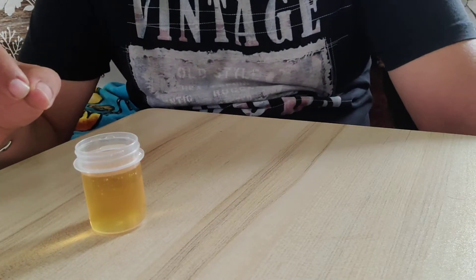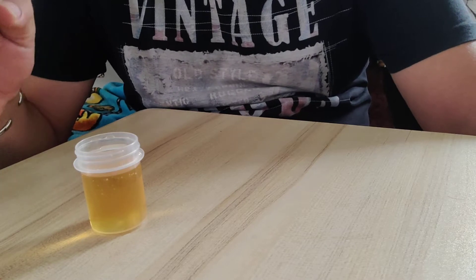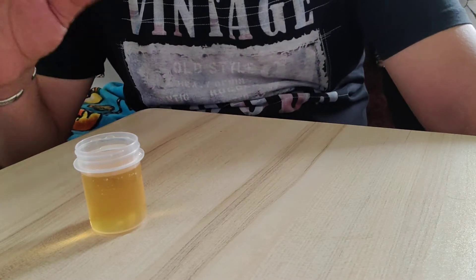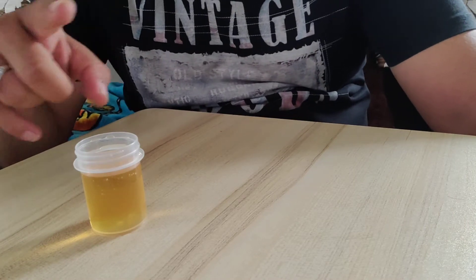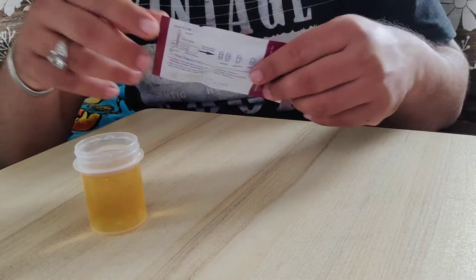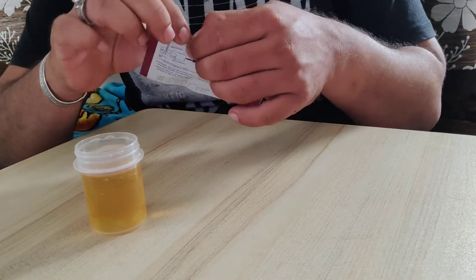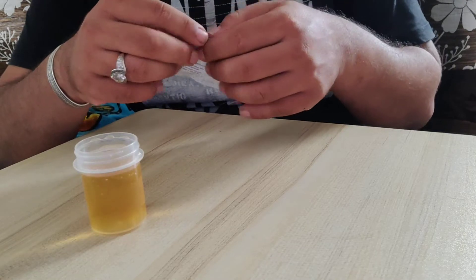The urine sample required should be collected from 10 o'clock in the morning till 4 o'clock in the evening, because the LH hormones in the urine are very concentrated at this point of time. Do not use the first urine of the morning.